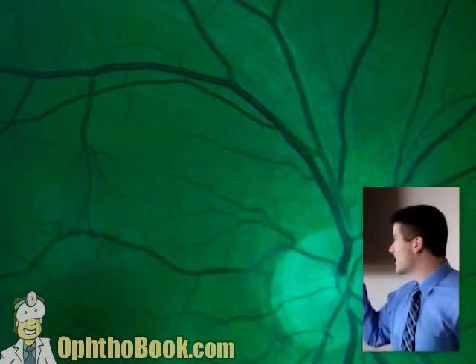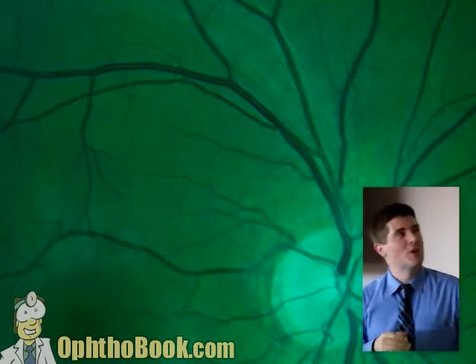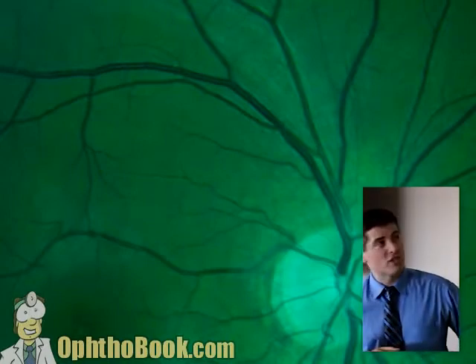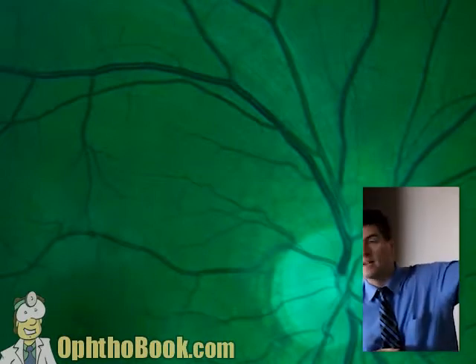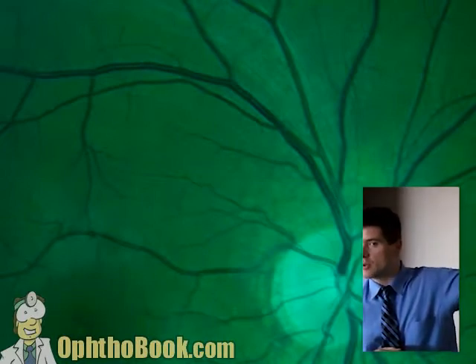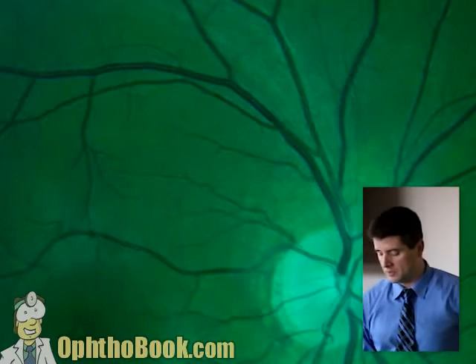And when people have glaucoma damage, it's that nerve fiber that becomes damaged, and sometimes you can actually see a pattern of dark band right in the middle of that, which seems to correspond with any scotomas on their visual field.